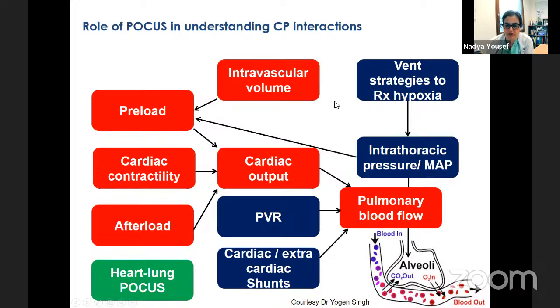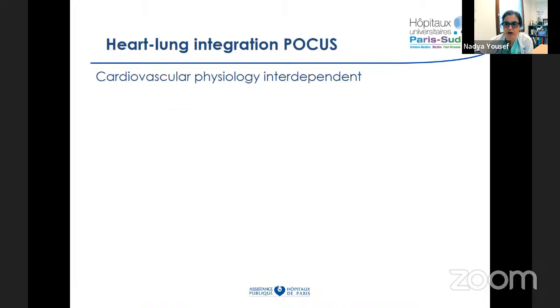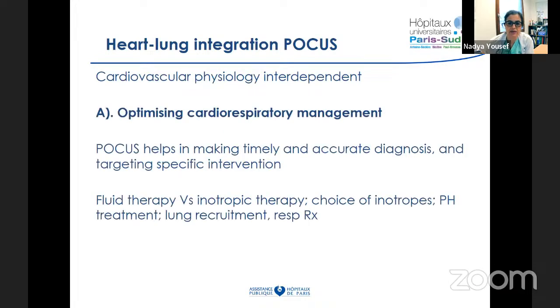We have a patient with hypoxia, and we could start off, let's say, in a position where we have decompensating patients or patients we're treating. And this is where point of care ultrasound seems to be very interesting, because it gives us a number of insights that we would not get otherwise by chest x-rays or clinically. For example, if we're doing cardiac POCUS, it might help us in our choice of management. Should we then, for hypoxic or hypotensive patients, give fluid therapy?